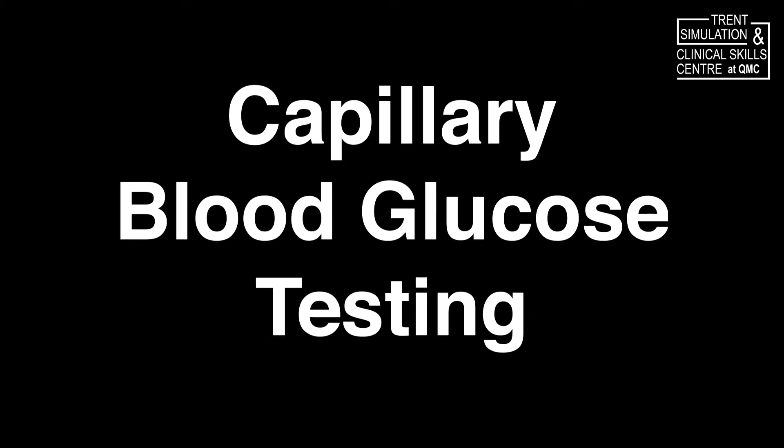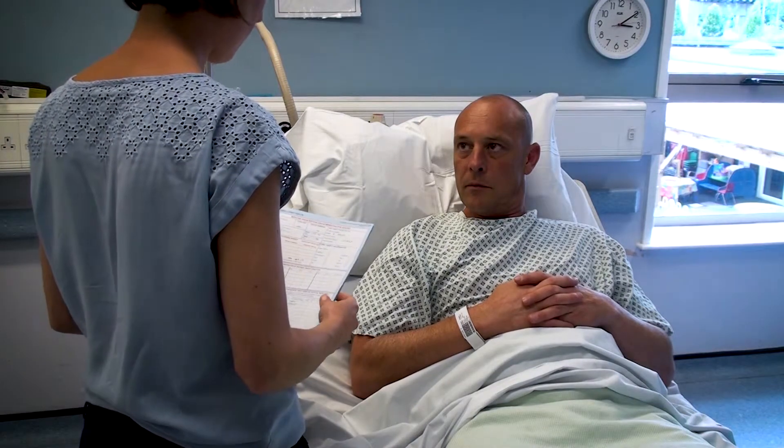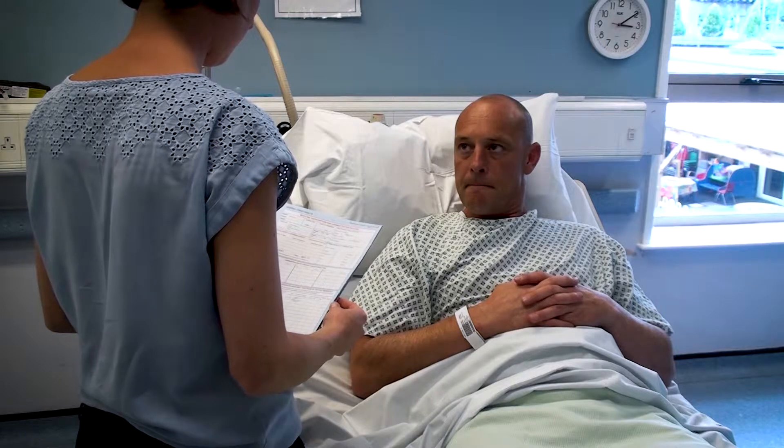Welcome to the clinical skills video for capillary blood glucose testing. Prior to performing this procedure, you must ensure that the patient has been informed of what you're about to do and you've obtained verbal consent.